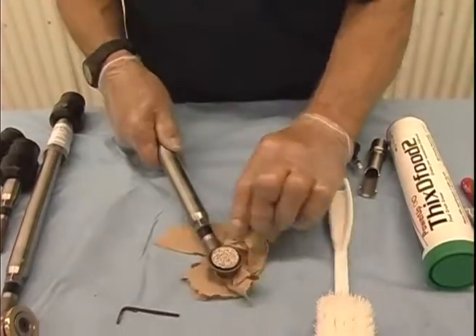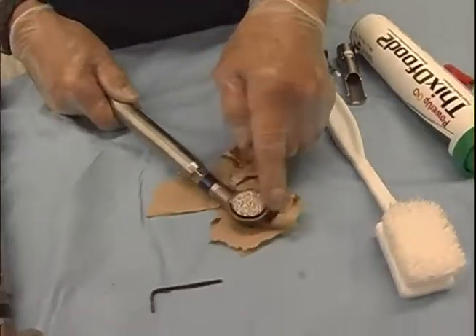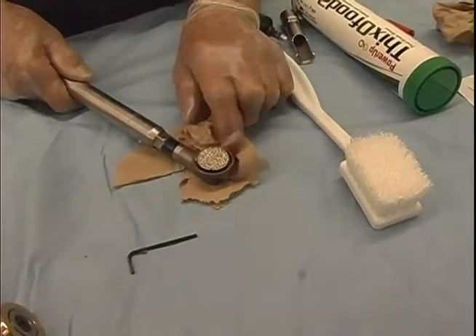There are ball bearings in here, and over time, as things wear a little bit, the grease will come exuding out around the edge of the grinding wheel. This is normal because it's just oozing through the ball bearings underneath the wheel.